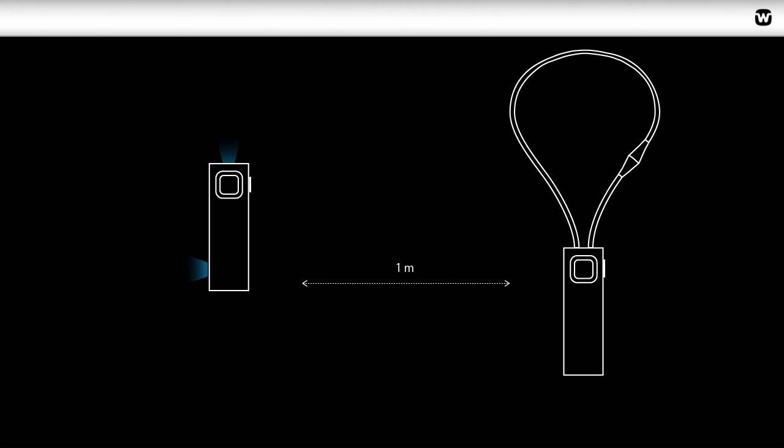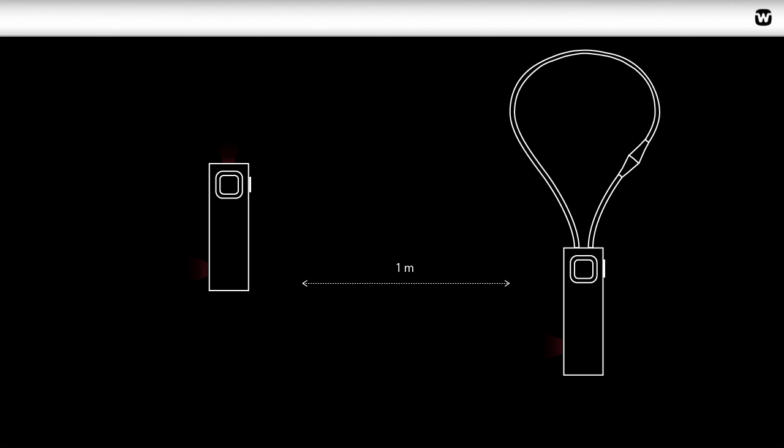Make sure the Comdex is in pairing mode. A blue-red light flashes on the LED light to indicate it is in pairing mode.